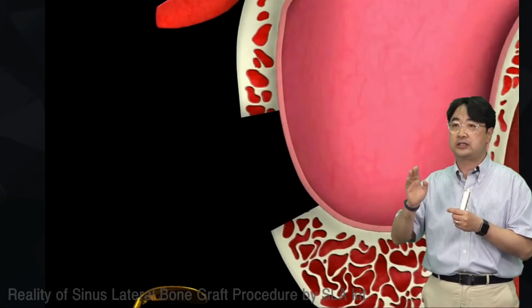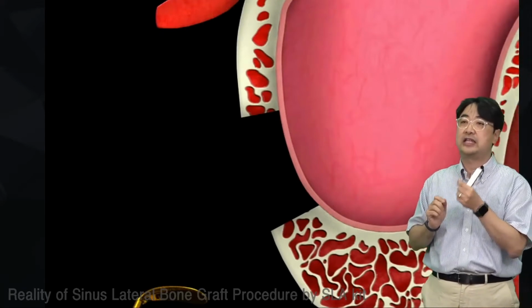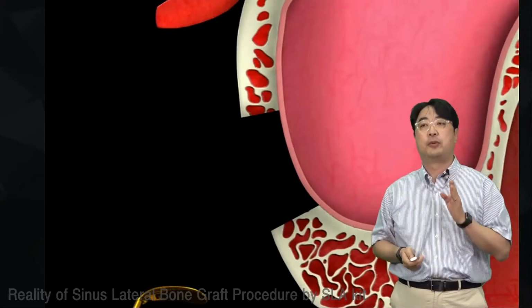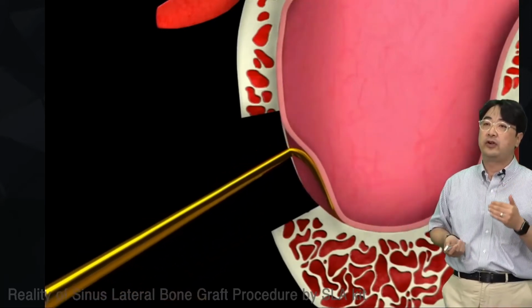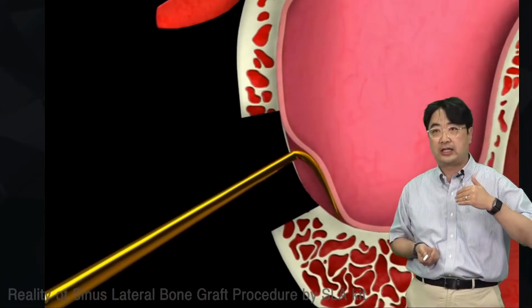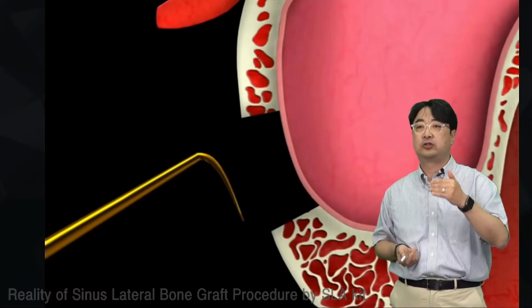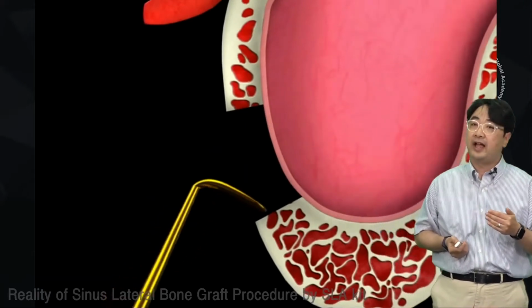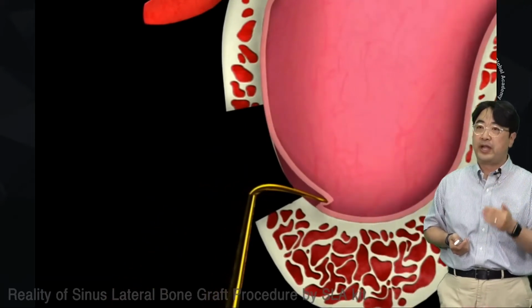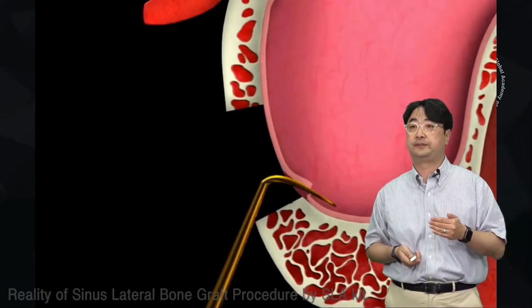But when you push out, the end of the tip of this instrument has to touch the bone, okay? So this is how it works. So with the Freer elevator, you push out, right? And the end of the tip has to touch the bone itself. If not, you may have a tear during the dissection using the Freer elevator.